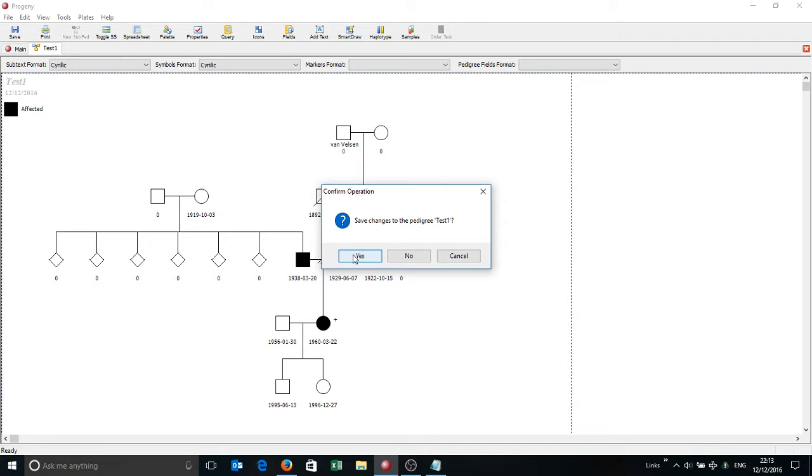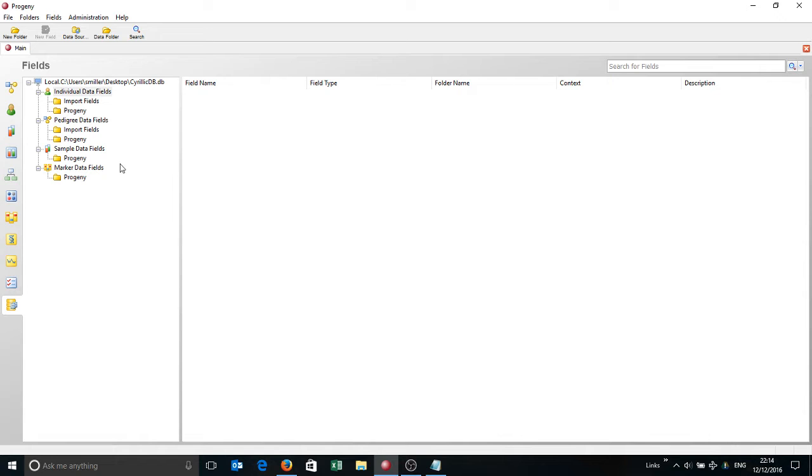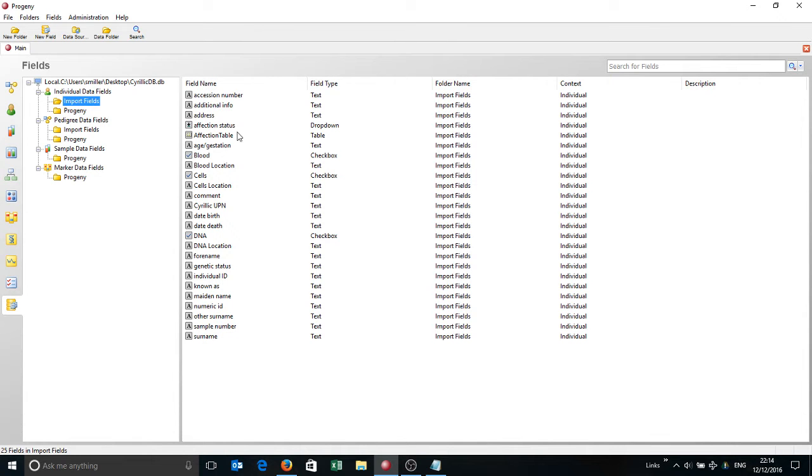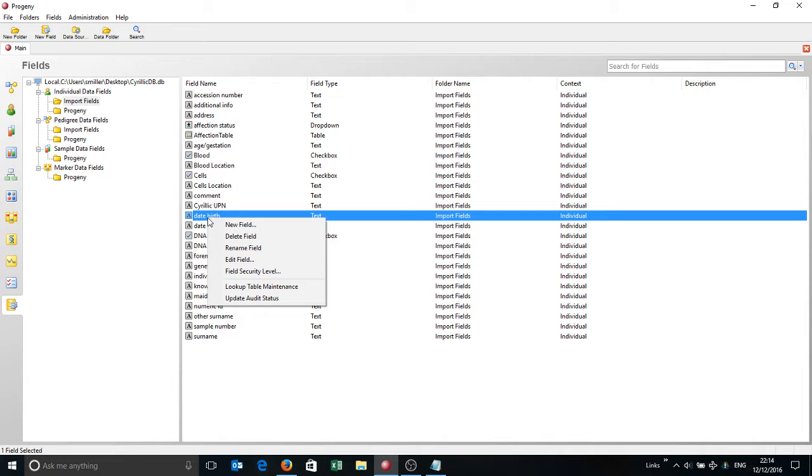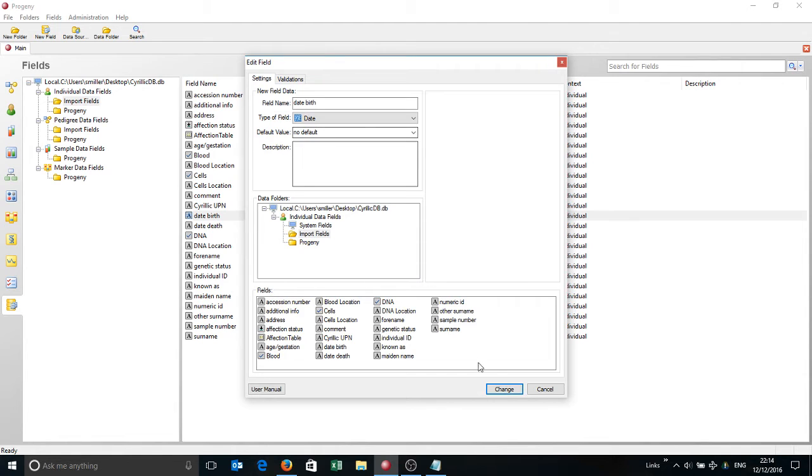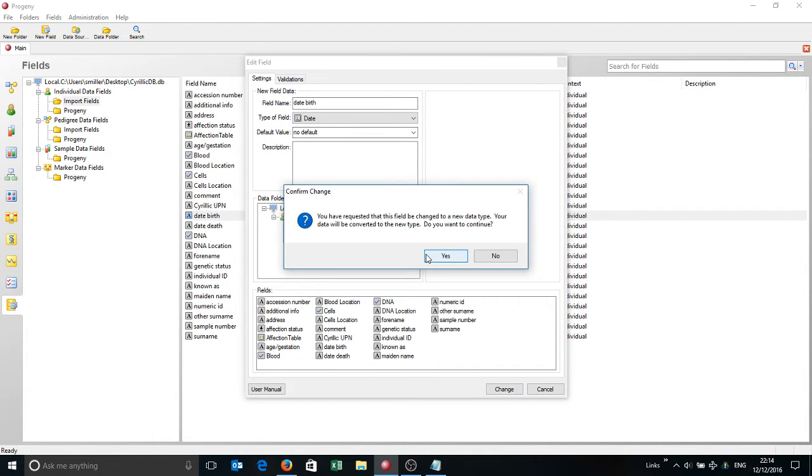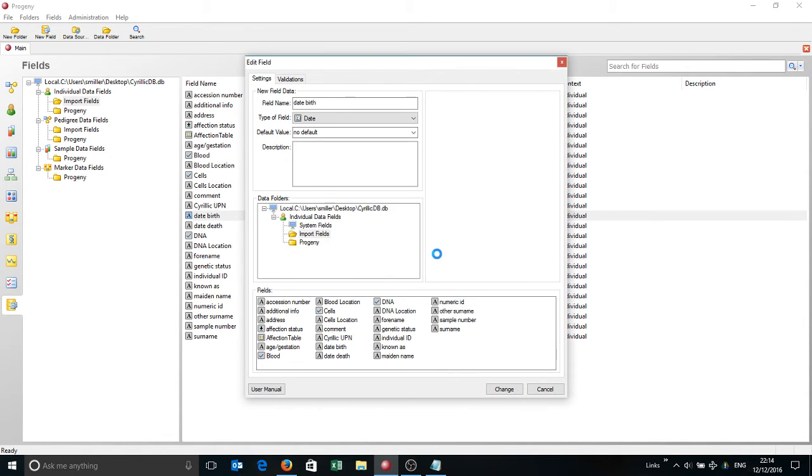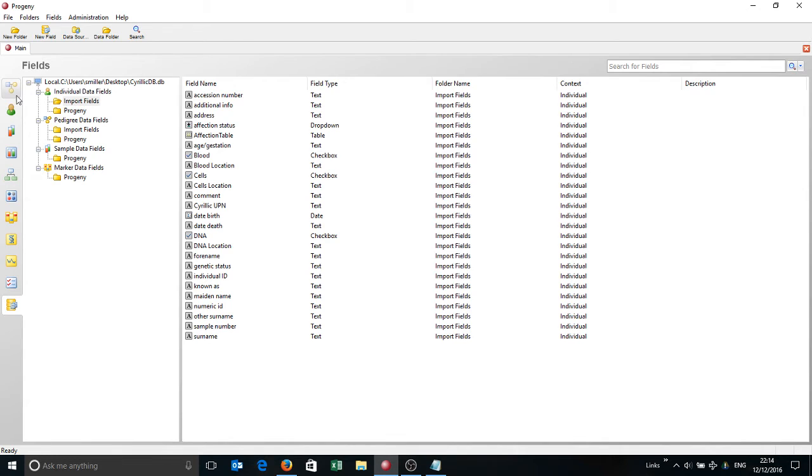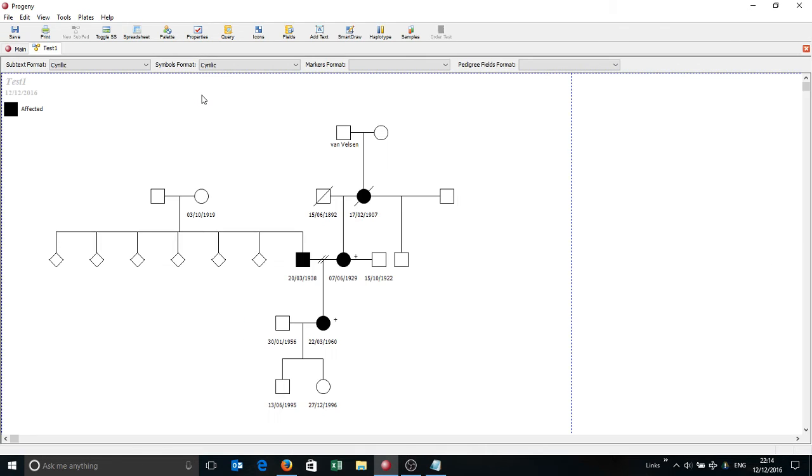So I just want to go now to the date of birth field from Cyrillic. I'm actually going to right click on that and edit the field. I'm simply going to switch it from text to date, like so. Click change, and if you're doing this, be careful, because obviously you can really mess things up. A good thing to do is to take a copy of your database before you do this, a backup for example. So we're going back to the pedigree, let's have a see if that's looking. And that looks fine. You'll actually see it's reformatted it into the European format in this case. So it's gone from how it looked in Cyrillic to how it kind of should look.